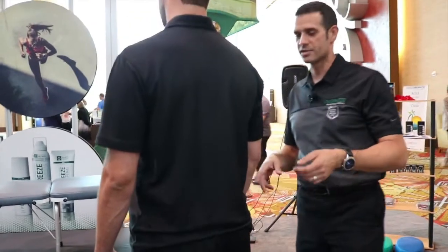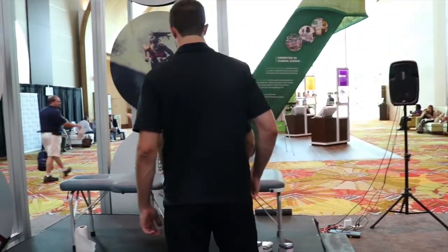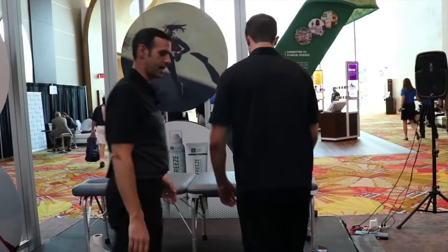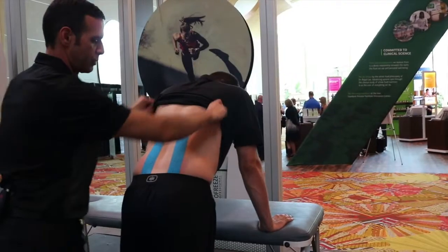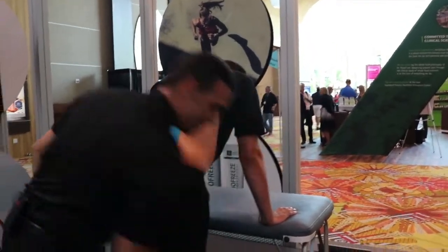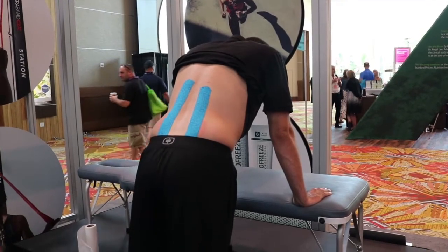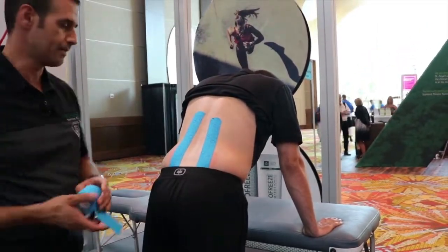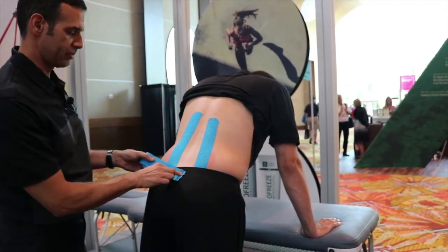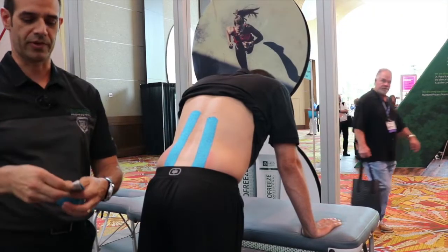And in this particular case, we're going to have him just move over just a little bit here. And if you can just use the table and just lean on that for a second. Now, what we're going to do with this one, we can again use our kinesiology tape. And this is going to be a correction for a left posterior ilium. So we're going to measure from sacrum to lateral lumbar, and we're going to cut 2 strips of tape for this.